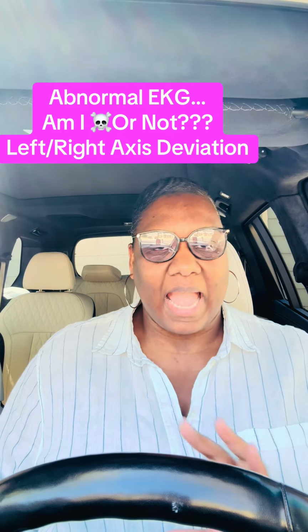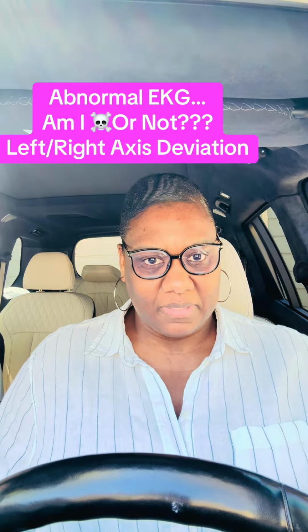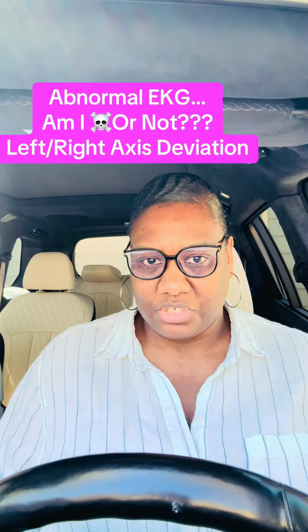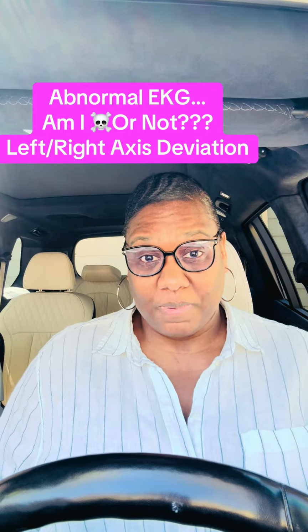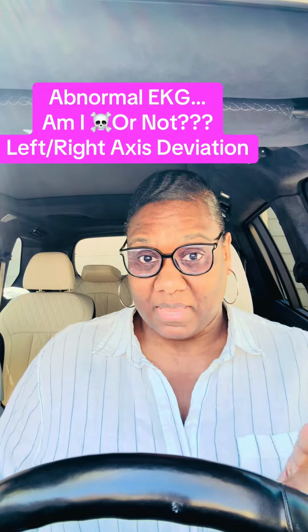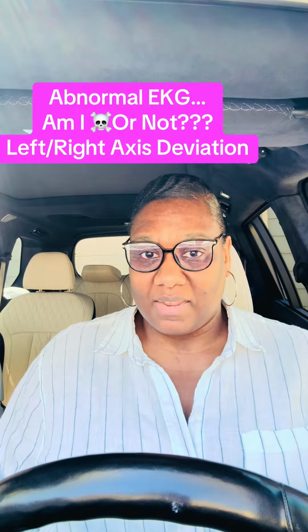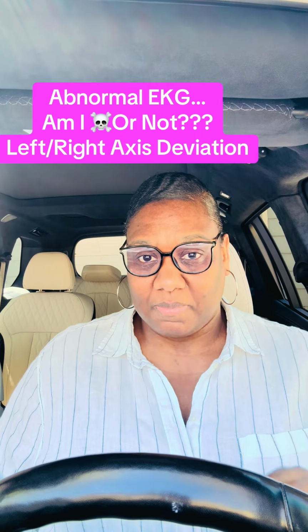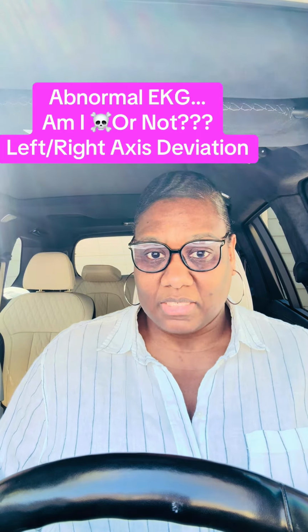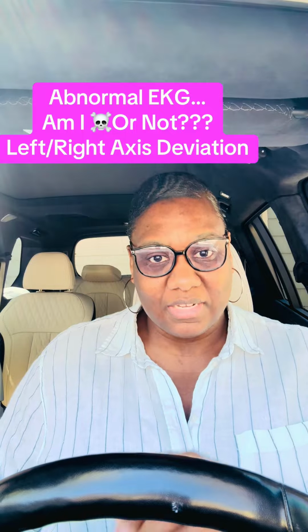Hypothetically speaking, if you have right axis deviation plus concerning symptoms, it could mean that there is an underlying pulmonary issue, possibly COPD, possibly emphysema, possibly, and here's a big culprit, sleep apnea. The right side of the heart, students and new graduate nurses and NP students and NPs for that matter, we all know that it is the right side of the heart that is responsible for not just receiving blood flow from the body, but actually pushing that blood flow into the lungs.